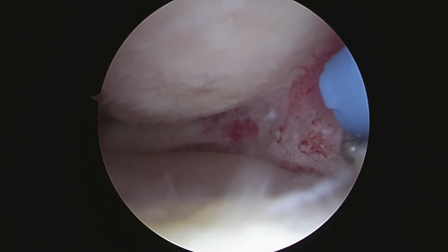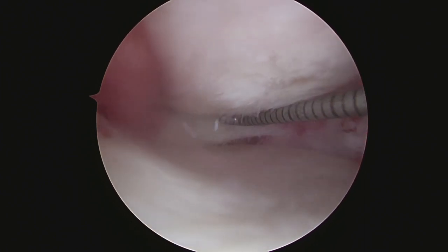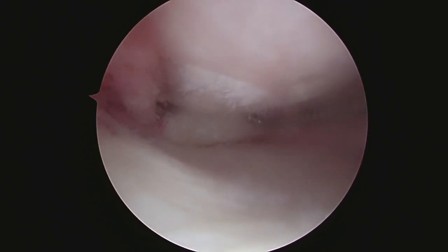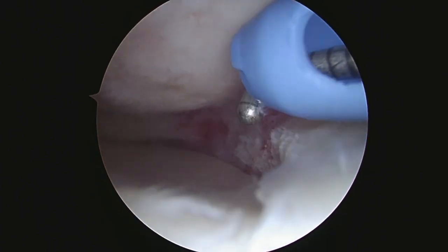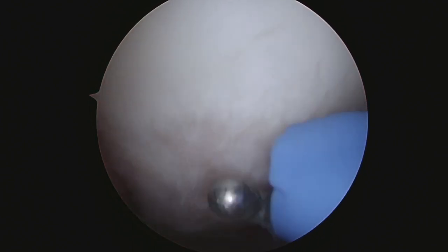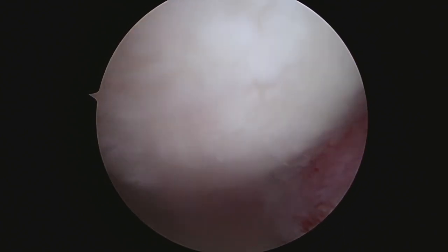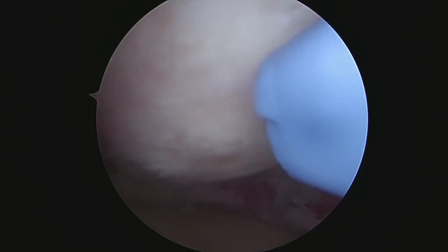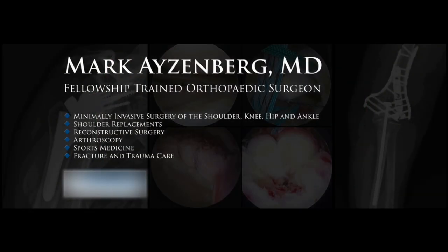Okay Roselle, we're all done here. You could see we resected the meniscus to a nice smooth transition. We'll get some of that ooze gone for you. You can see a nice smooth transition in the back towards the front where we resected all the way to the anterior horn. That looks great. You have a little bit of arthritis here we just cleaned up. We're going to go to the upstairs of your knee and clean up that little flap on the side, wash it out, and we'll be done. So you did great - make sure you use lots of ice. Call me if you need me, and thank you for your trust.